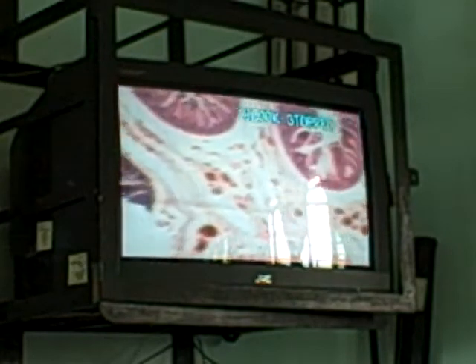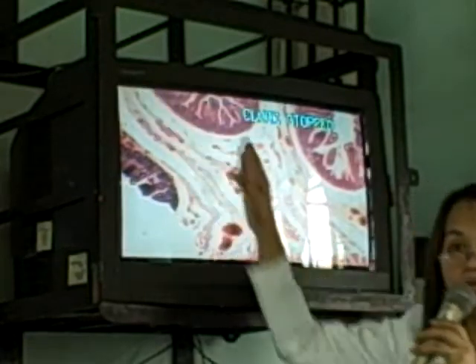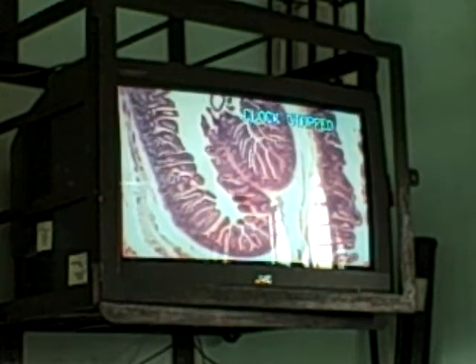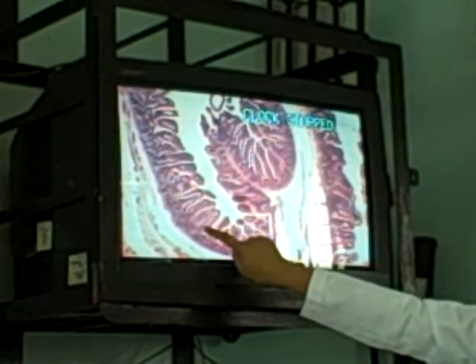Okay, let's skip first the duodenum. Let's proceed to jejunum. Look at the prominent plica circularis. That's your plica circularis. Look, if you go to the basal portion, that's your submucosa layer, but extending as your plica circularis. Right? And where's the villi? These are individual villi, made up of lining epithelium and lamina propria in between.